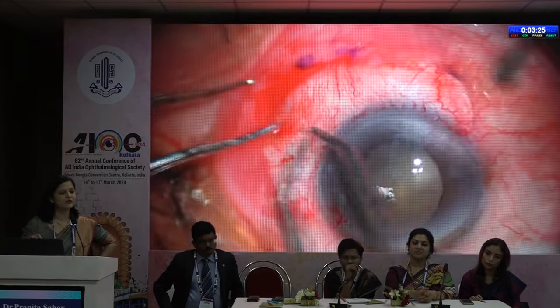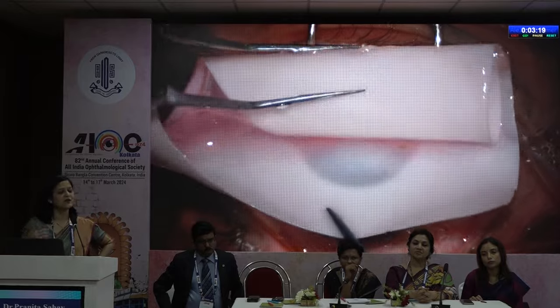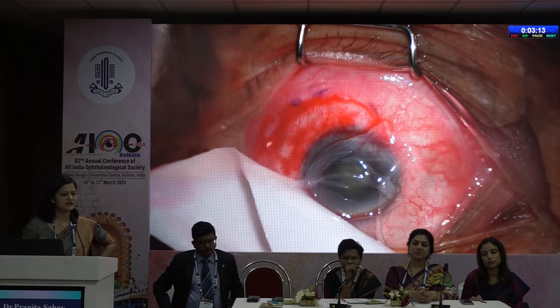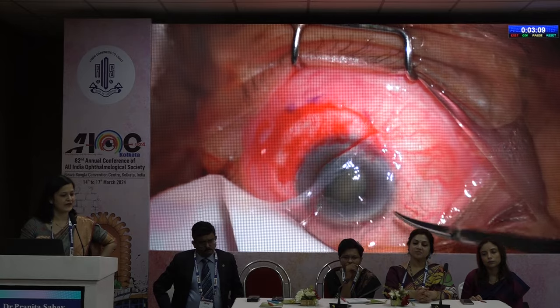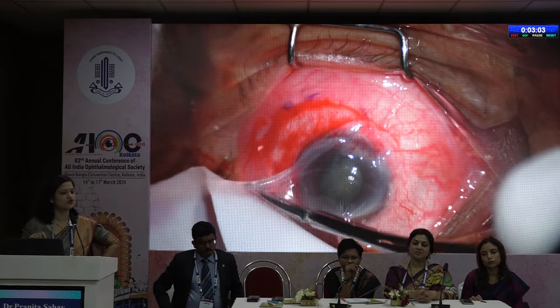It is very important that once you remove such a mass, you cauterize all the bleeders very well, because these bleeders tend to form a sub-AMG hematoma that can lead to infections. So cauterize all the bleeders. You can see this is the nitrocellulose blotting paper. I am removing the AMG from the blotting paper and putting it on the corneal surface. I am putting it epithelium down. Now here the stroma is up.